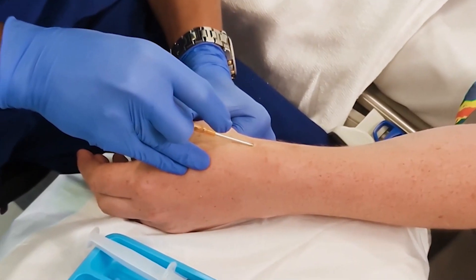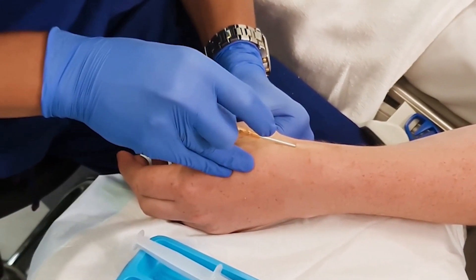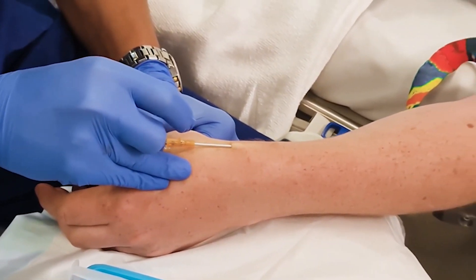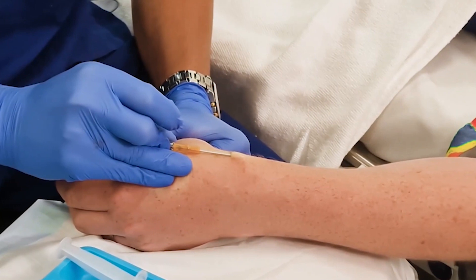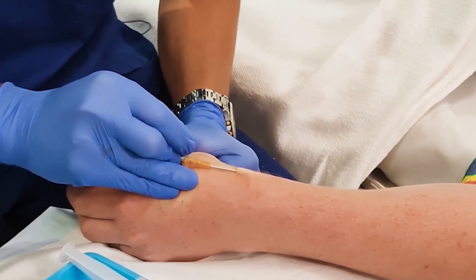That concept is well displayed in this video of a large cannula being inserted. Notice how once first flashback has been obtained, the cannula is flattened significantly — even as far as picking up the vein and skin with the back surface of the cannula without causing any trauma — allowing the cannula to be threaded off the introducer.